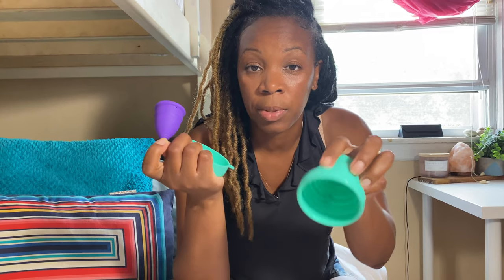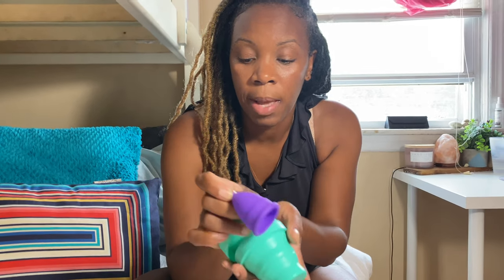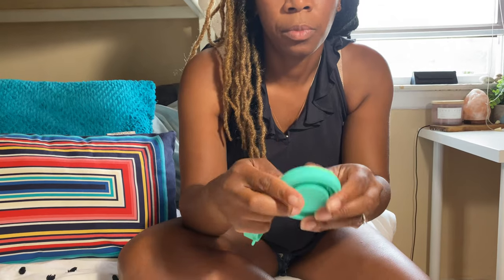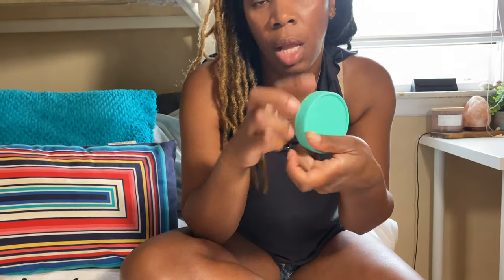After you finish reinserting, you open the sterilizer cup, dump the content also in the toilet, close it back up. Simple, simple, simple. And now you're able to go about your business.